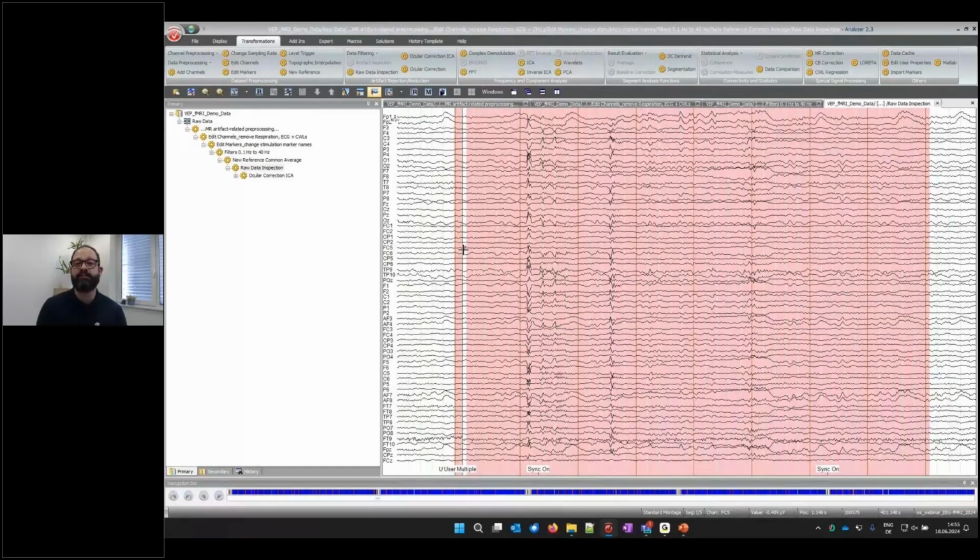The reason is simply that if there is a break, our participants tend to move a little bit, stretch a little bit, maybe move their face a little bit. So usually there is more noise in these portions of the data. And while we usually don't analyze these portions of data later, there might be some processing steps affected by this noise. Therefore, it's better to mark them with a bad interval. Because the bad intervals remain in the data at this time.